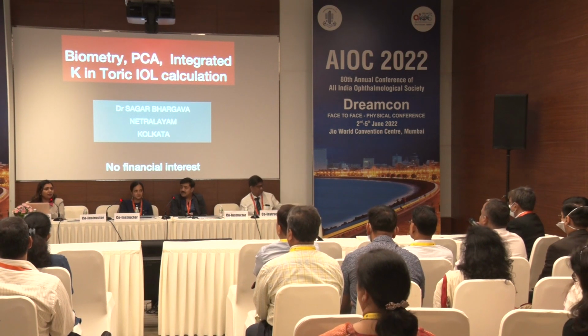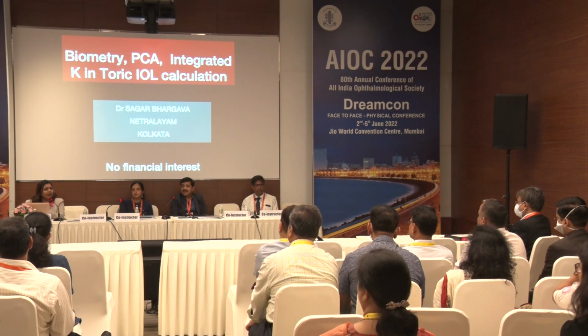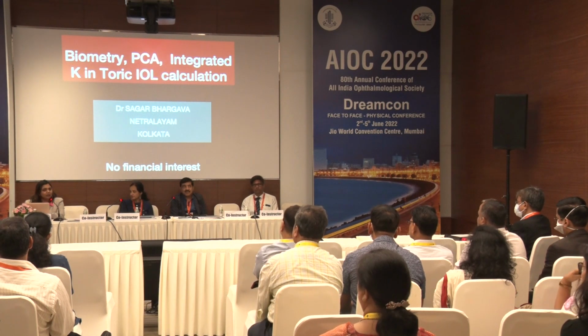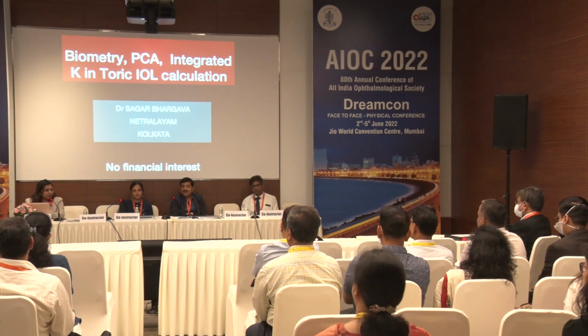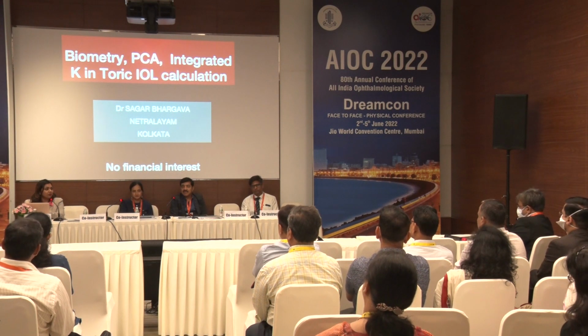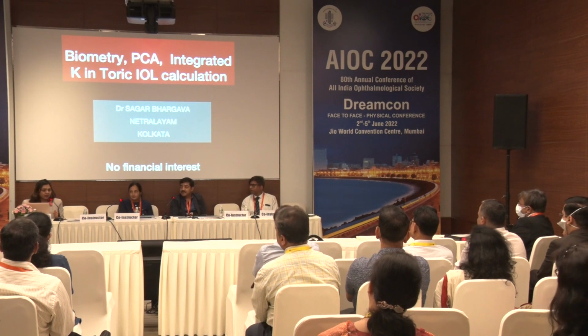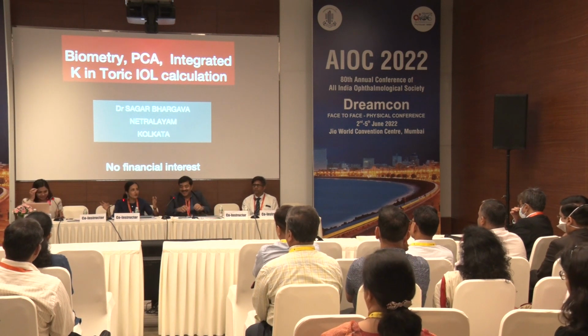Another important thing I would like to add here is to consider the profession of the patient. I had a patient who was a diamond merchant, but he was myopic and had an AC depth of 5.5, which was against all odds. Still, I went in for the CTR during the surgery to take care of the bag, and I went for the toric IOL, explaining to the patient, because post-operatively he needs good crisp vision. He cannot wear cylinder or magnifying lenses. So you have to understand the personality and the profession of the patient, and also counsel about taking them back to the theatre if required.